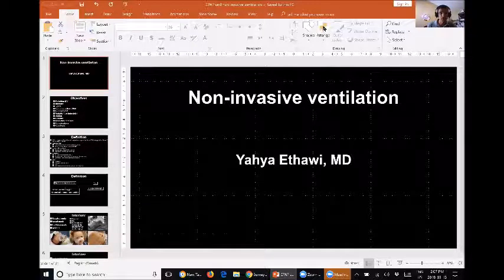What does CPAP offer? It offers mainly two things. It offers oxygen, and it stents the upper airway, and it decreases work of breathing. So it reduces the work of breathing by providing oxygen and stenting the upper airway, also distending the alveoli. All of that will provide better oxygenation and then reduce work of breathing. And second, it provides ventilation, or it improves gas exchange. And by connecting the CPAP, you will simply avoid an ETT, because we've said CPAP, or non-invasive ventilation, is providing breathing support without an ETT. And because there is no ETT, you don't need sedation, and you will not need muscular and neuromuscular blockade or muscle paralysis. And of course, by avoiding an ETT, you will avoid invasive mechanical ventilation.